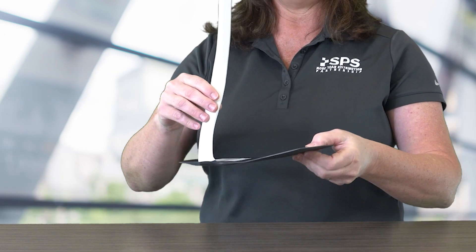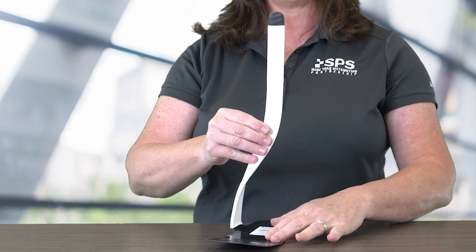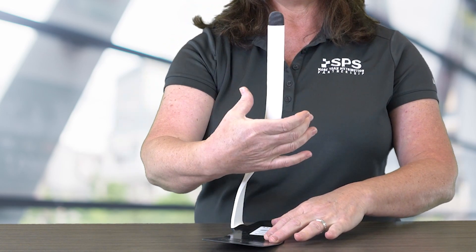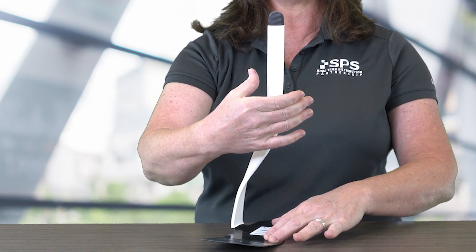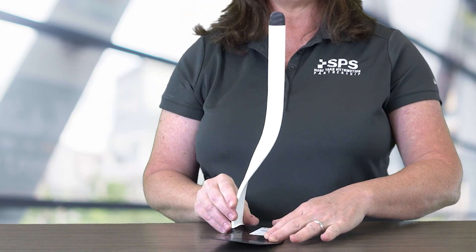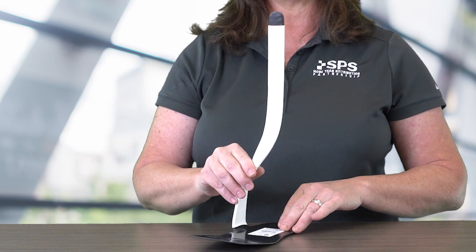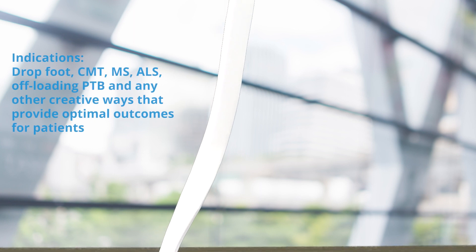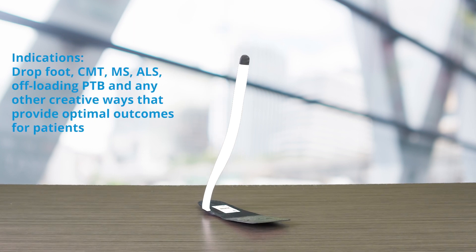Next, we're going to show you the Matrix Max Raw. The Matrix Max Raw is a lightweight carbon composite, which is ready for the practitioner to create a custom anterior ankle foot orthosis or partial foot prosthesis. It comes in one size and can be adjusted to match the patient's sizing. It is intended for patients with foot drop, CMT, MS, ALS, offloading PTB, and other creative ways to provide optimal outcomes for patients.